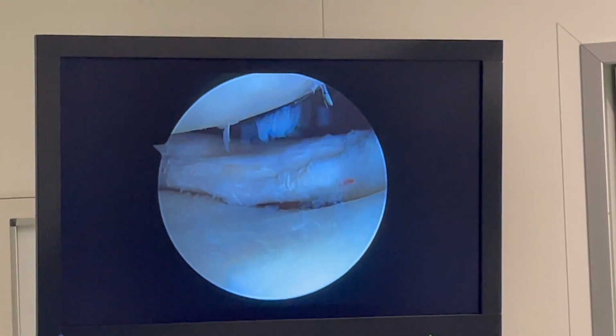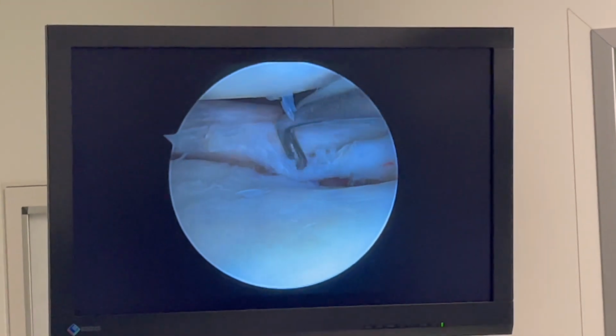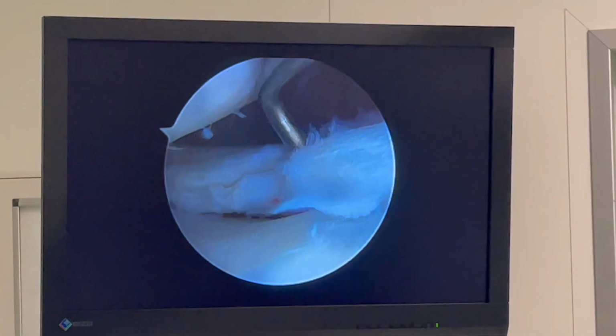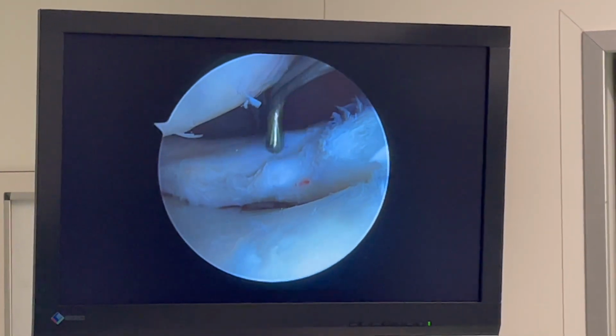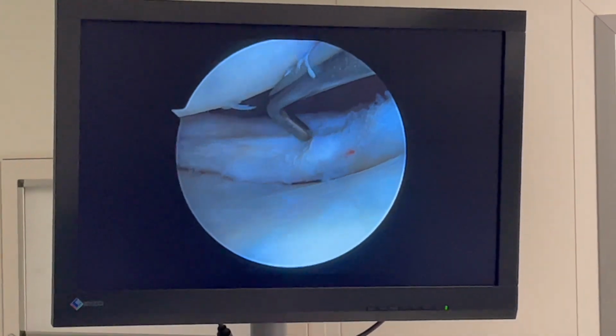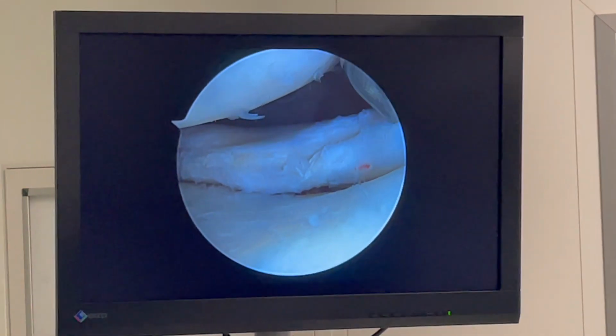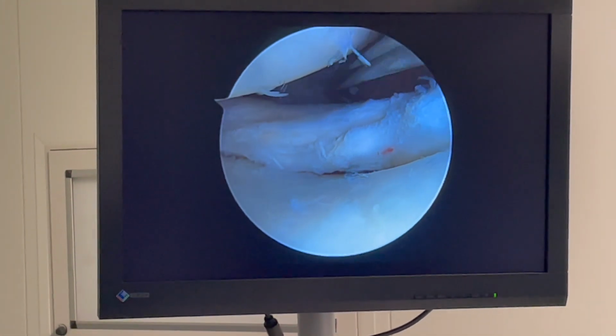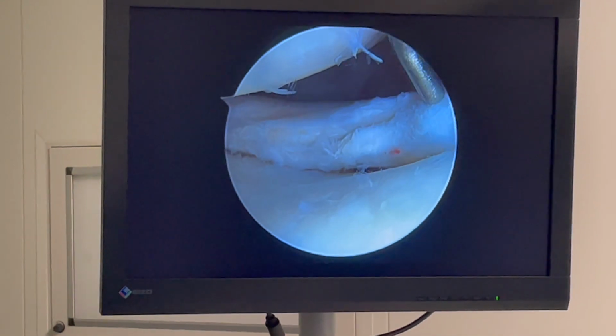Otherwise we can just trim this one off if we have enough. That's okay with you? Right, so then we'll do it. Those are special sutures and they cost 100,000. One is enough, right? If you can put one across like this.